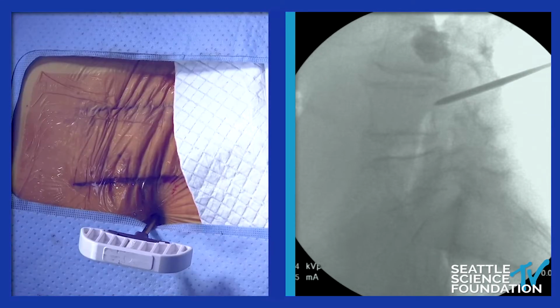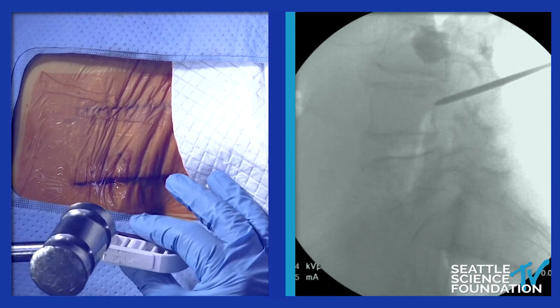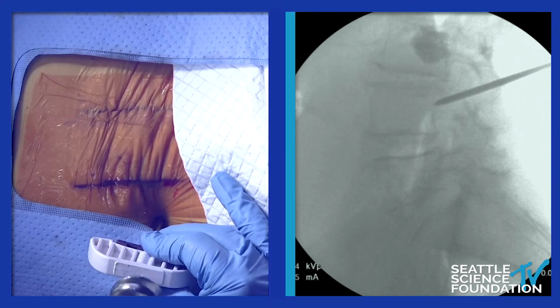We're going to be accessing the vertebral body here. I'm in the AP view. I've met right up to the medial line of the pedicle, and you can see in the lateral view, I'm about to enter the vertebral body. So that's optimally what you want to be doing as you're going in from a unipedicular approach.